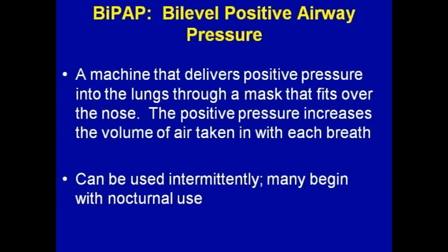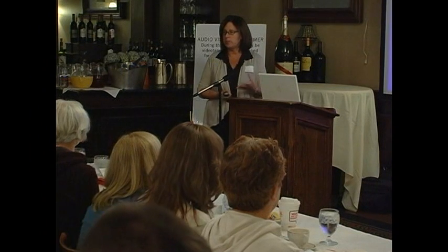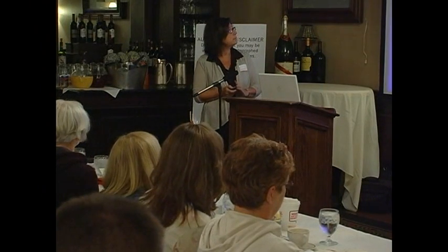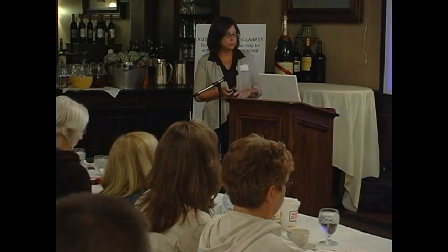Most people with respiratory muscle weakness, whether it's from ALS or another condition, start using BiPAP initially at night because, as we talked about, nighttime lying down is usually the time when people begin to have problems, for the reasons we talked about.